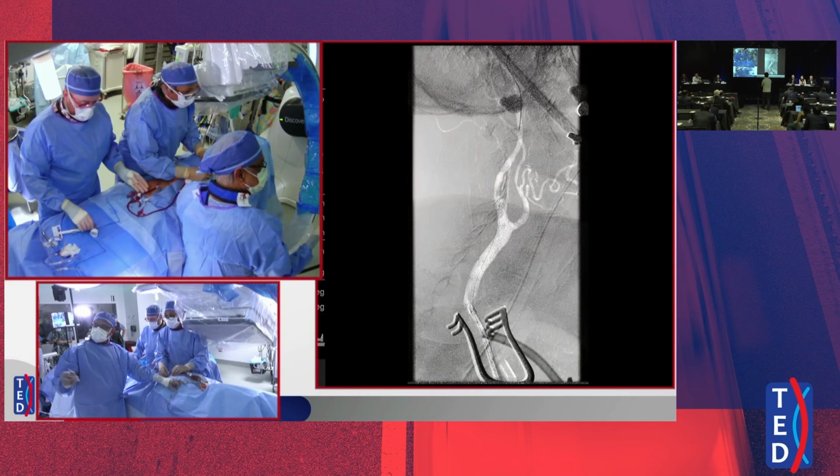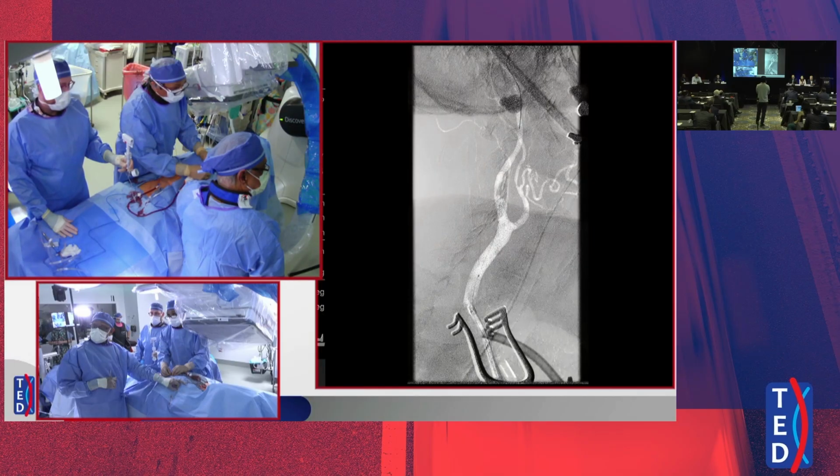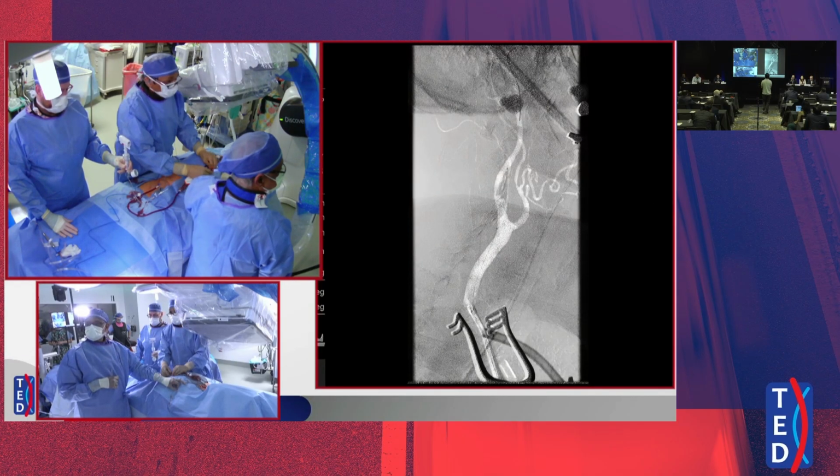Okay guys, we're live. We've crossed the lesion. I'll give you the history in a second, and we'll talk about it. As you can see in the picture, this is a very tight lesion here, mainly in the internal.